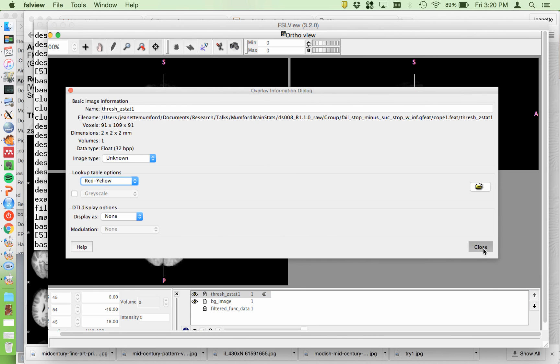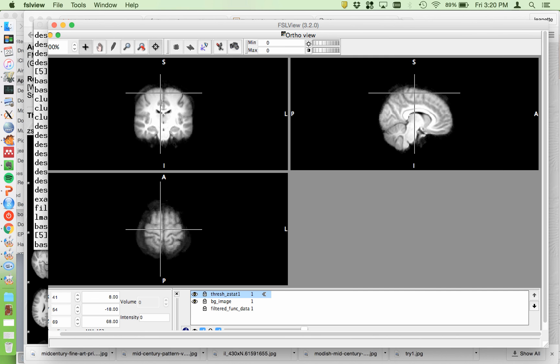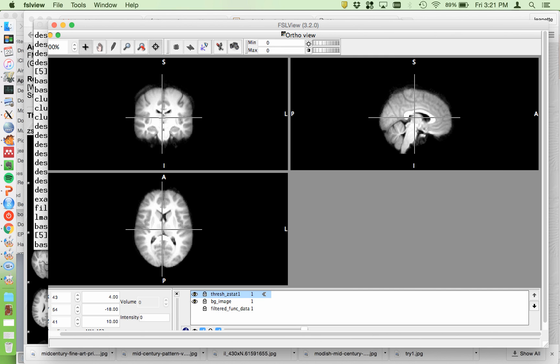But this one isn't going to have any. But what you can do is if you don't have anything that met the threshold criteria, you can add the zstat which is in the stats directory.